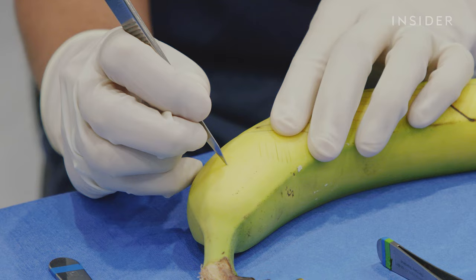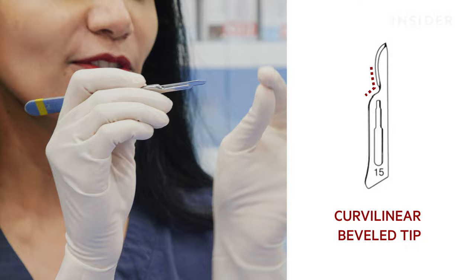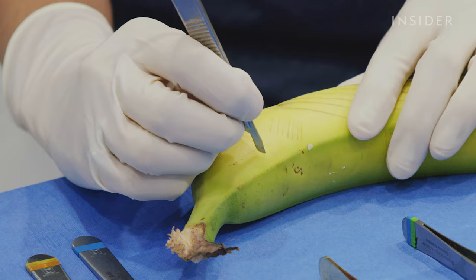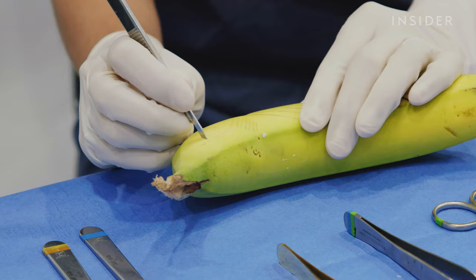And this is a 15 blade. A 15 blade is one of the most common knives used in plastic surgery, and it has a curvilinear bevel at the tip and can be used for a medium type of incision and can be very multifunctional. So for a facelift or for a breast augmentation, a 15 blade can be a very beautiful option.